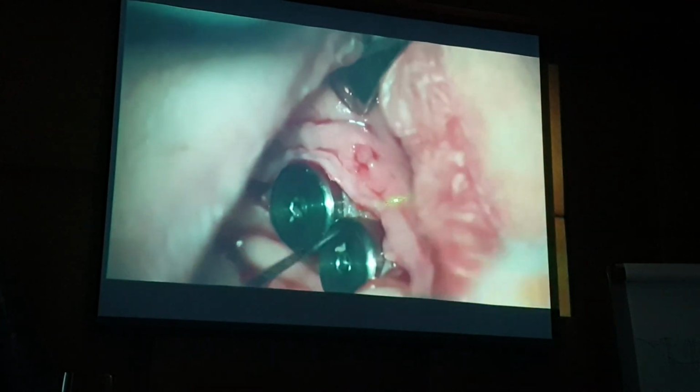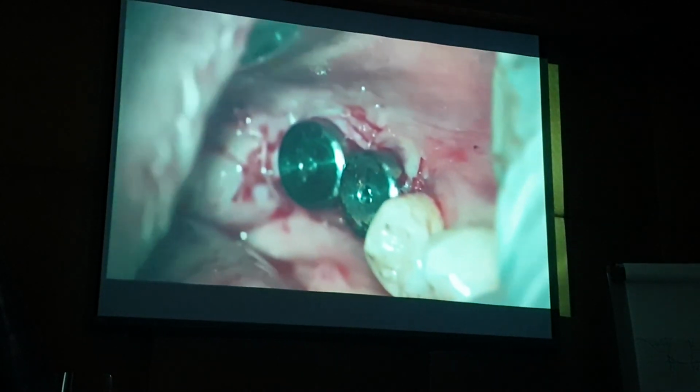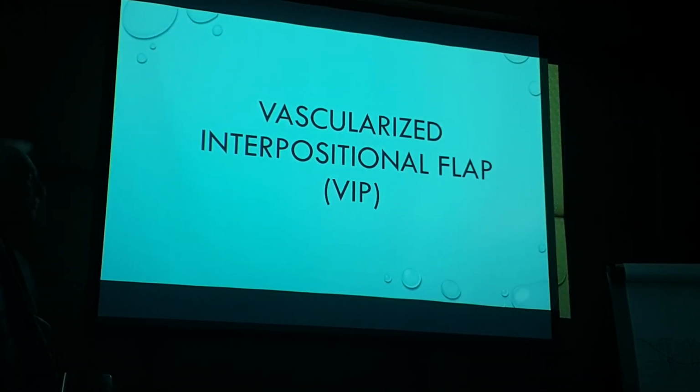But that's as close as you're going to get your flap now, interproximally. So this PRF will now cover this. We'll place at least a couple of membranes there. That's it, and it feels beautiful. No need for any rotation, just normal incision. That's it.